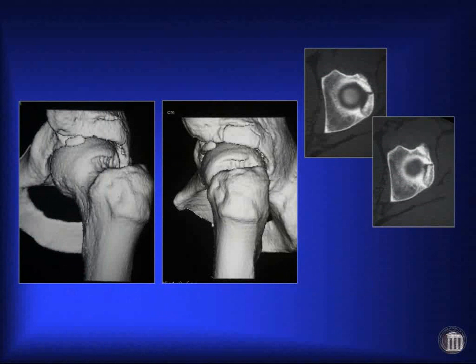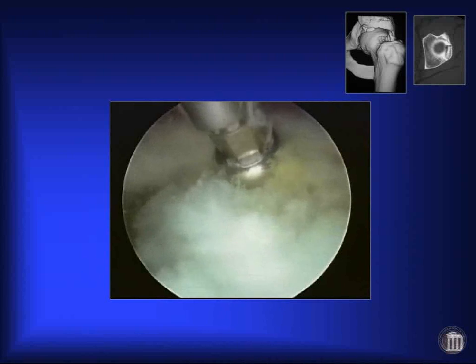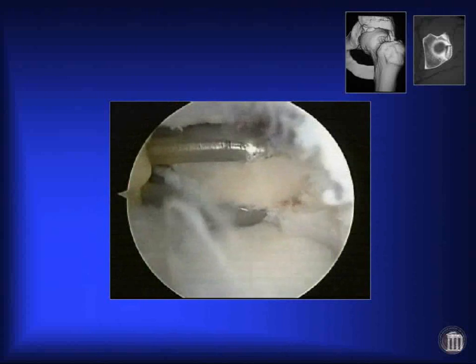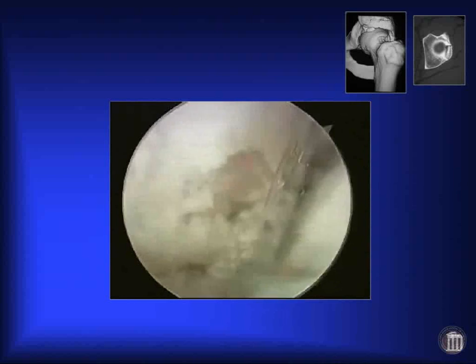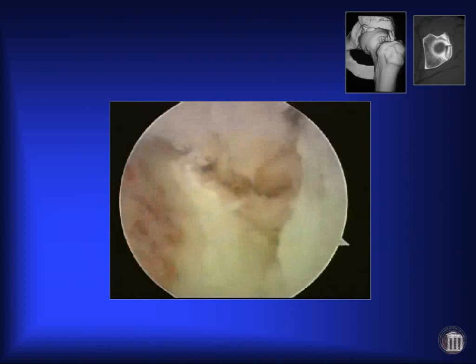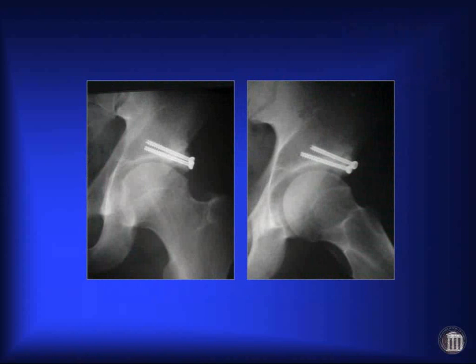And oh yeah, on the Marine, here's his lesion. We went in arthroscopically. We fixed the posterolateral fragment arthroscopically with percutaneously placed screws, getting a couple of screws in there with good compression to stimulate a healing response. We went anteriorly and removed the separate os acetabulum fragment off the anterior acetabulum, corrected the pincer lesion, refixed the labrum. He also had a painful snapping iliopsoas tendon, so we released his iliopsoas tendon to eliminate the snapping. Then we went to the periphery and corrected the cam lesion, addressing all aspects of this military personnel's underlying problem. Here's a finished product where we corrected the anterior acetabulum and fixed the fragment. This is his post-operative x-ray.